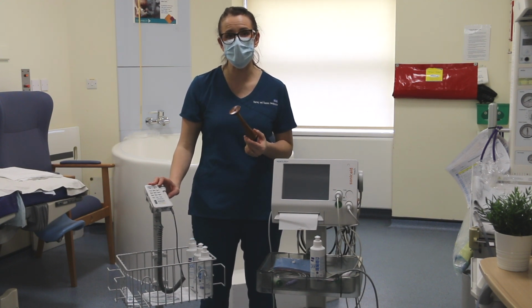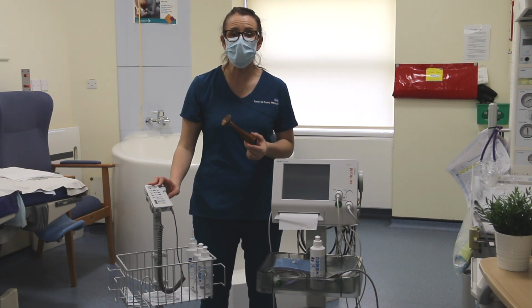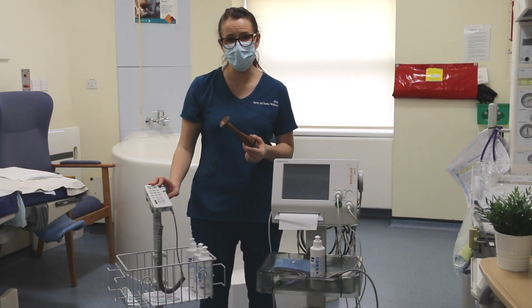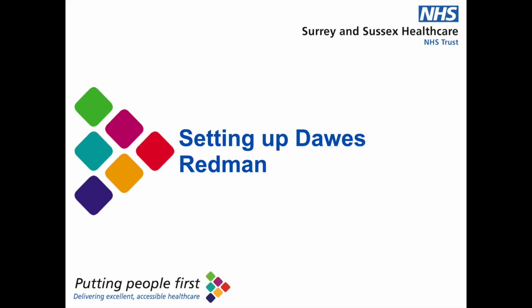The maternal pulse should be taken manually and should be documented on the CTG. This is important because the machine can pick up maternal pulse, double the rate, and then that can look like the fetal heart, and you can be measuring the maternal pulse erroneously.